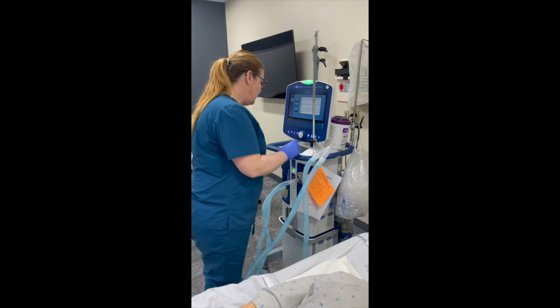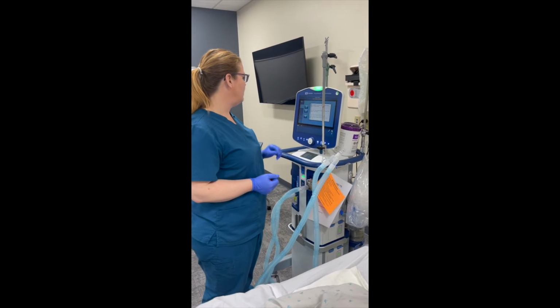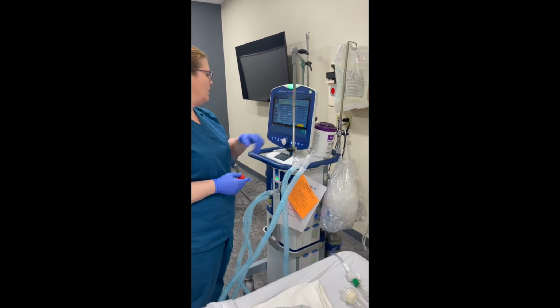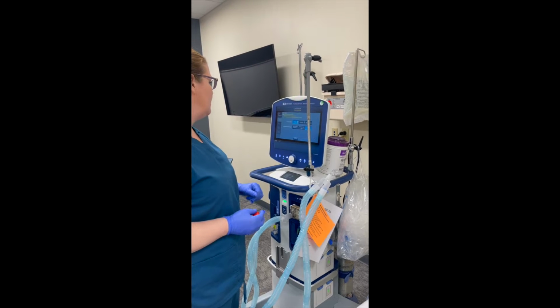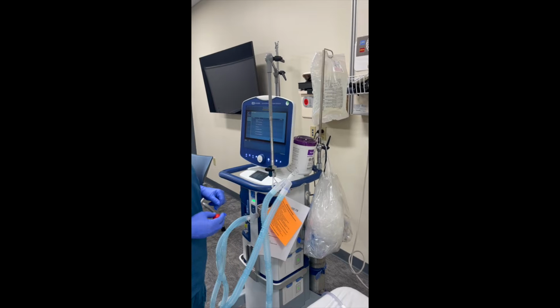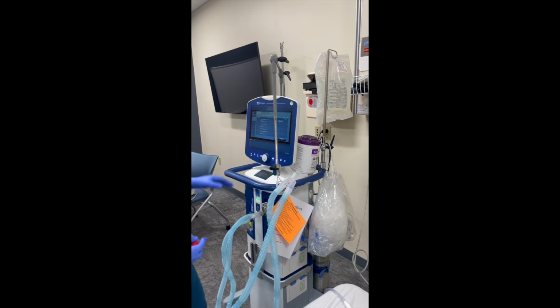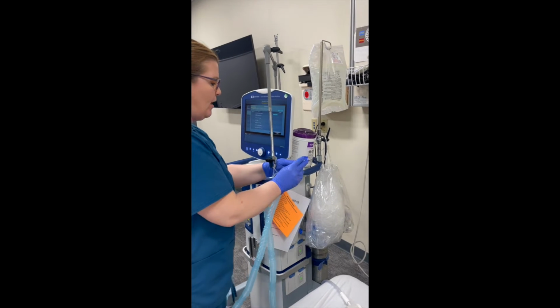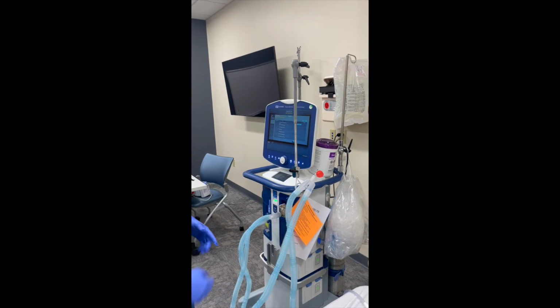Okay, so it looks like at this time we're going to need to run an SST, as an SST has not been performed. So we'll go ahead and select SST. Run all SST. Accept. So we're going to do an adult and HME. Okay, connect circuit with inspiratory filter and without humidifier. We have done this. So press connect. I'm going to go ahead and block the Y. Accept. So it's testing our O2.